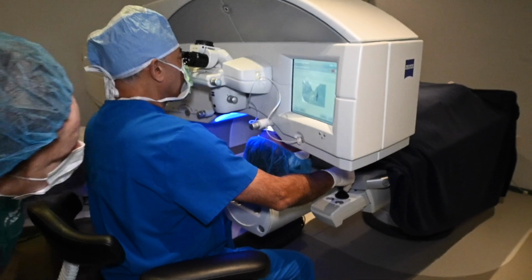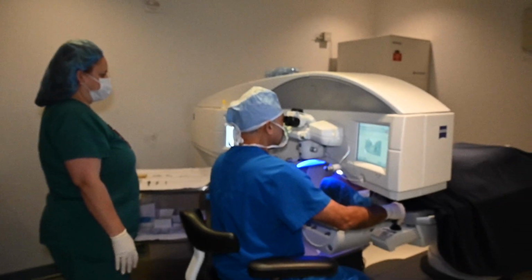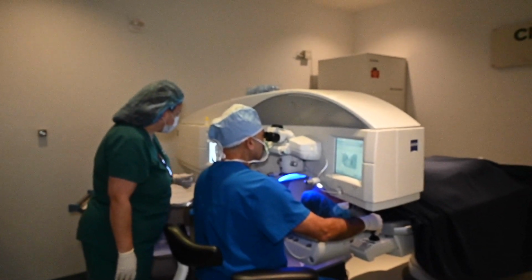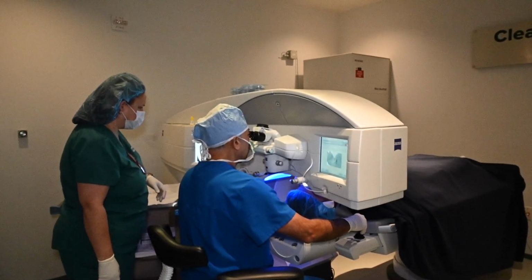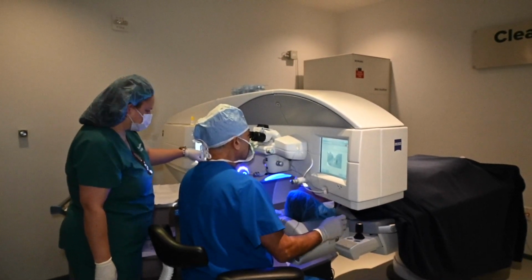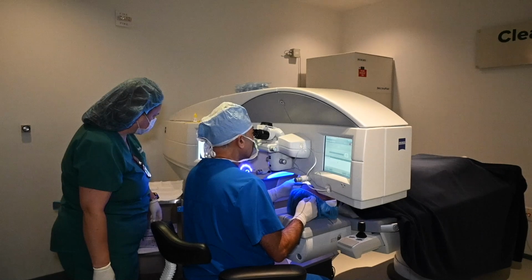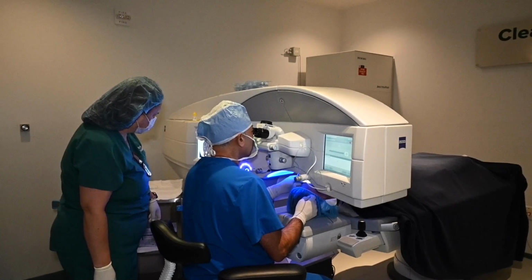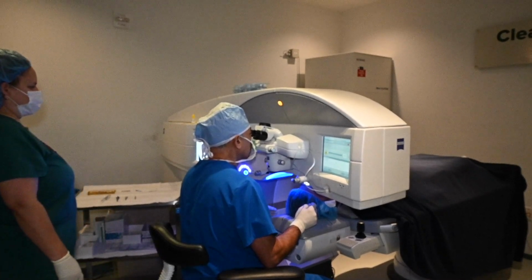But in some people, like high myopes or high hyperopes, it can be a little different. So let's say we're talking SMILE, so high myopes. Then we can adjust a little bit to fudge between the two. Don't get the wrong word, fudge, but we are using measurements to see where the center of the pupil is, where this line of sight is, and make adjustments. We have to treat the line of sight because that's where you see from, but also since we are making a disc, we want to make sure it is not too off center. Little technology and skill thing.